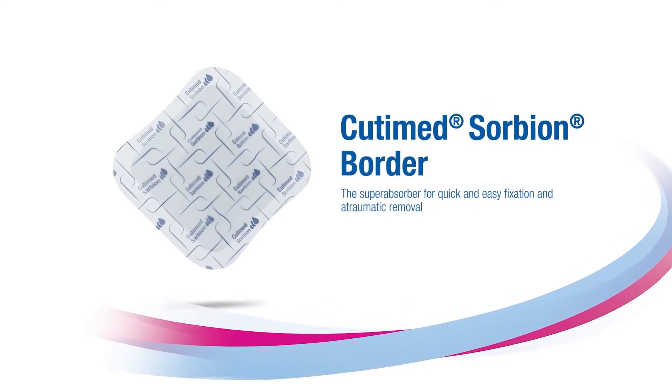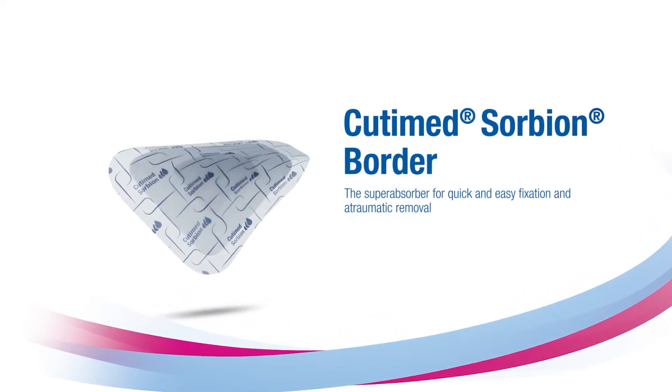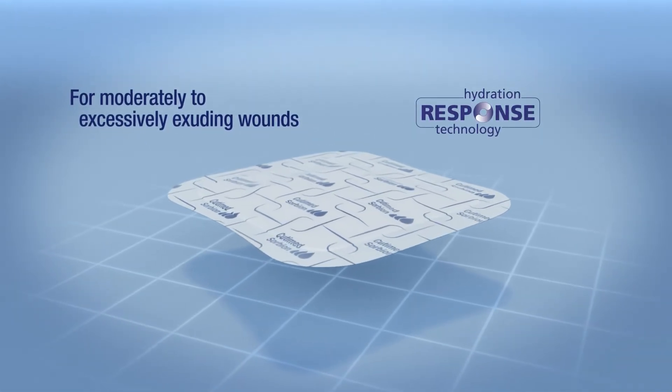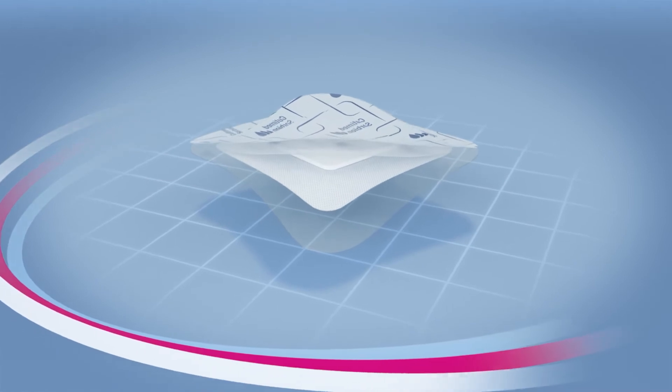Get to know Qtemit Sorbion Border. Excellent exudate management combined with quick and easy application, whilst also ensuring atraumatic removal at the same time.